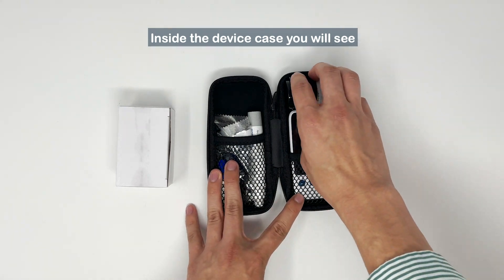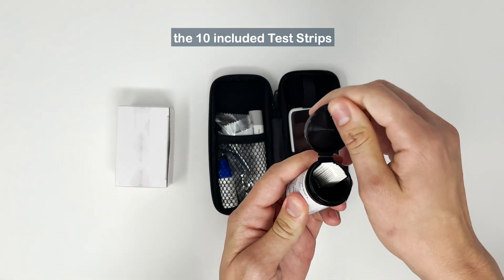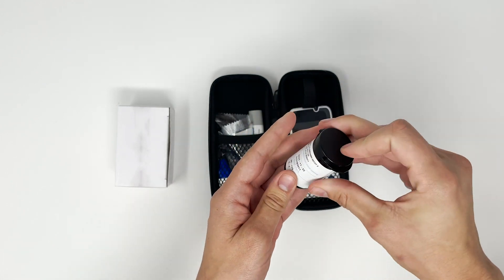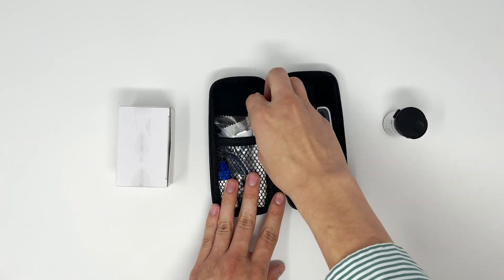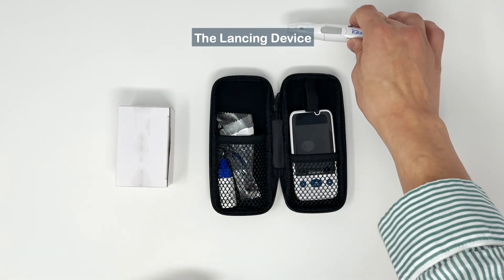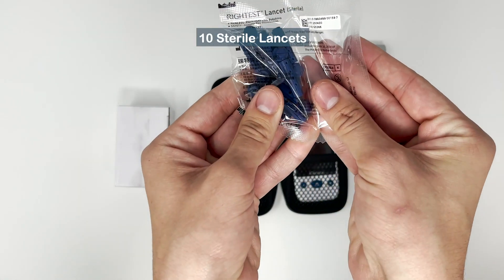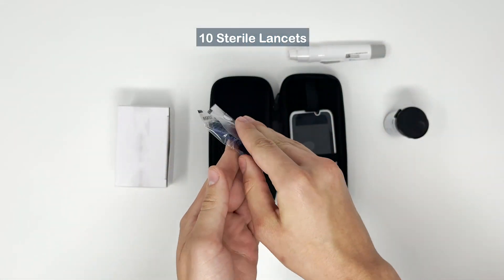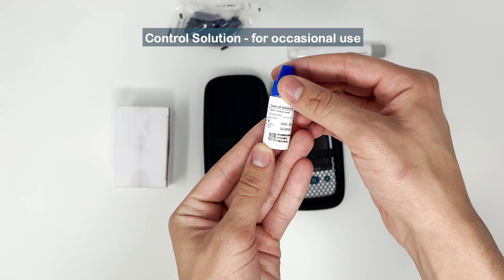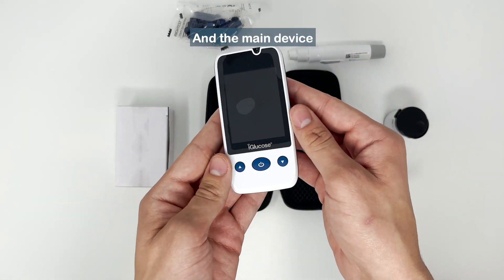Inside the device case you will see the 10 included test strips, the lancing device, 10 sterile lancets, control solution for occasional use, and the main device.